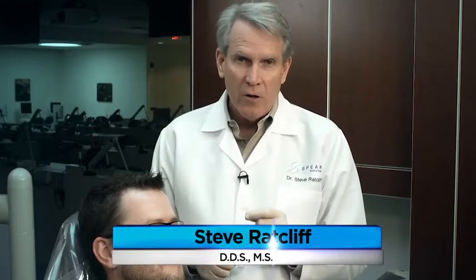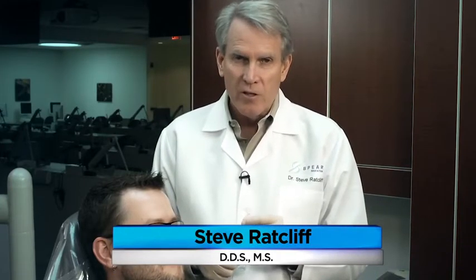In this lesson, we're going to understand how to expose two images. One is just a natural smile, and we'll have Scott smile for us, and we'll talk about how we're going to frame that. And the other is a retracted view with his teeth apart. Now, in the first lesson, remember we talked about taking 6 images that allow us to see every surface of every tooth. So this is how we're going to see the front teeth.